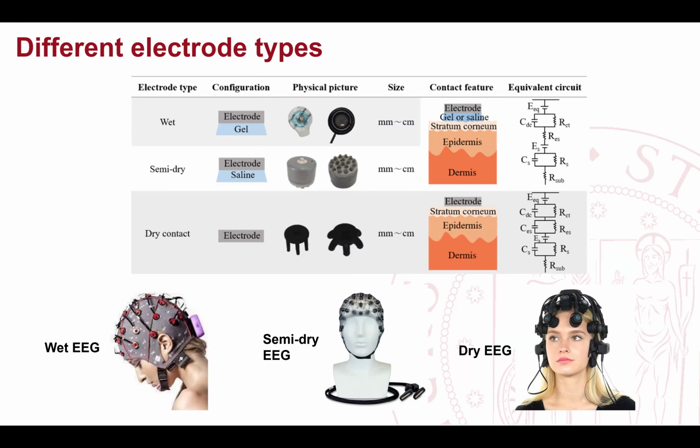So please, really, you can just put it under the water. It's not a problem. You just place the cap. Of course, not the amplifier, not the cables, but the cap. They are washable. They want to be washable. So you place it under running water, and with a toothbrush, clean it. It's not a problem. But it must be clean.